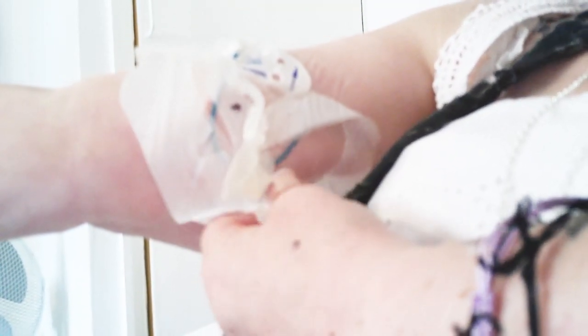So once I've got most of this off, I then clean up and don't touch any of this sterile area. But I just get as much off as I can first. Hands are clean and washed and gelled anyway. It's a case of making sure that you do not touch any of the sterile areas.